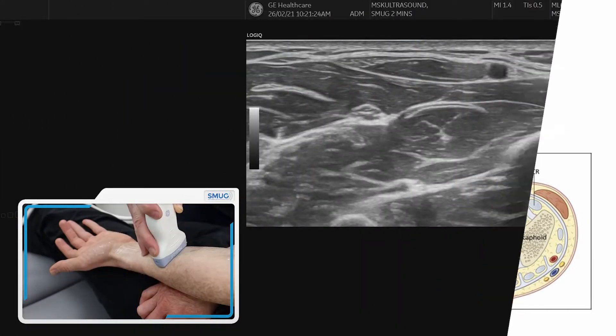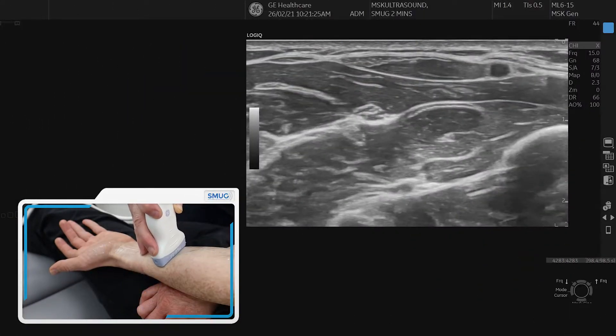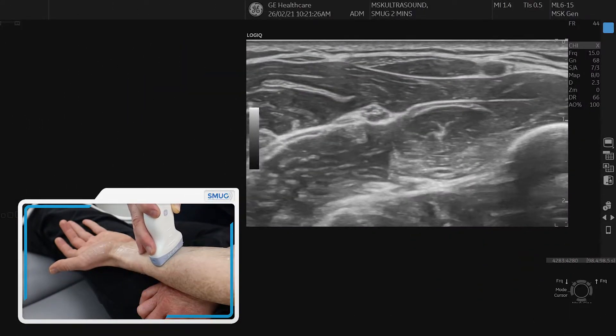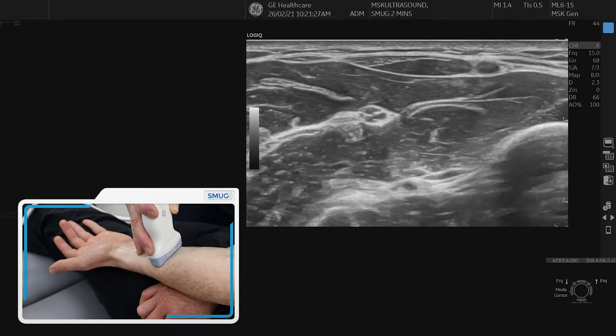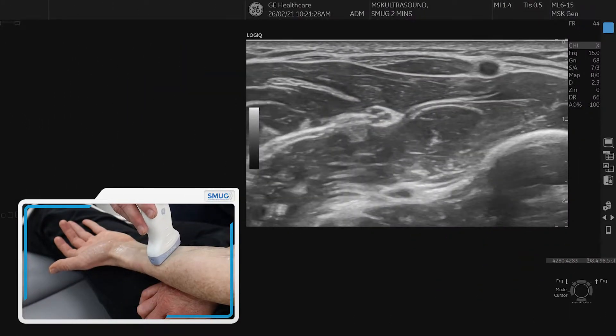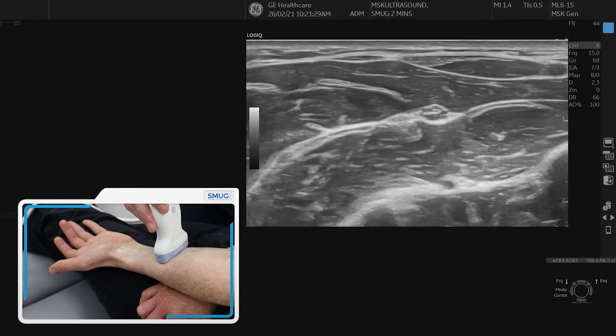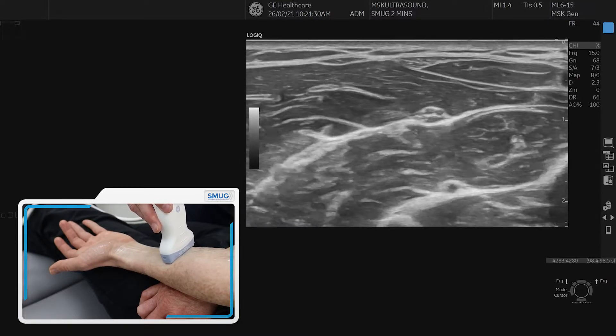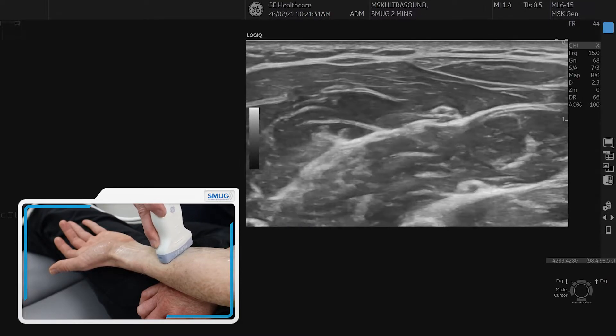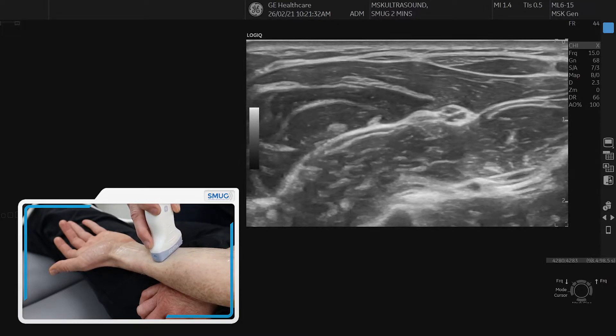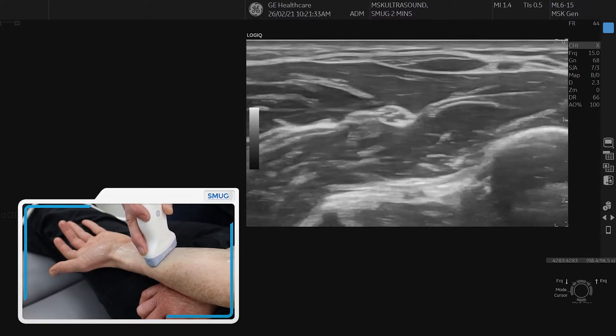We're going to show you the median nerve and how it goes into the carpal tunnel. We start in the forearm, identify the median nerve in its fascial plane, keep it in the middle, and trace it distally.